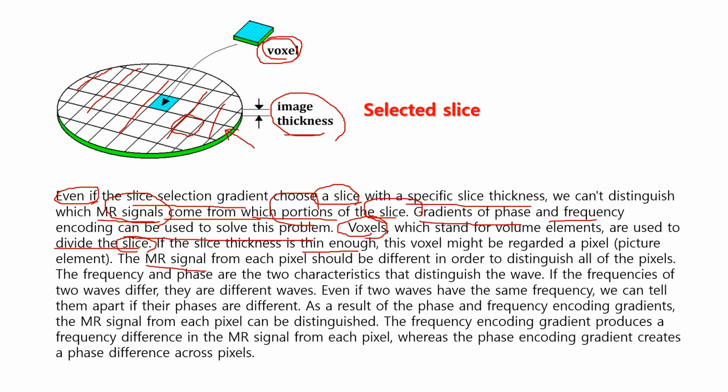The MR signal from each pixel should be different in order to distinguish all of the pixels.